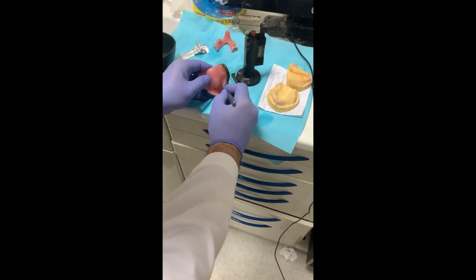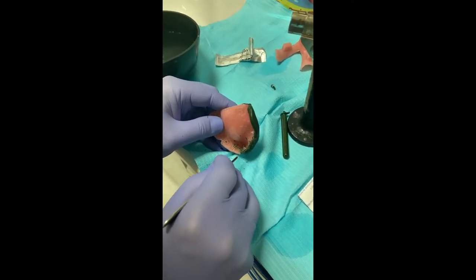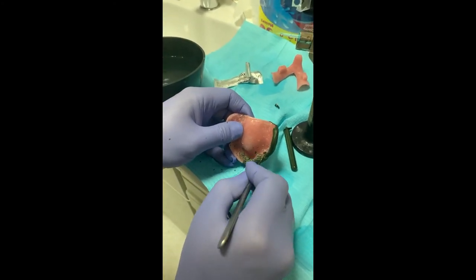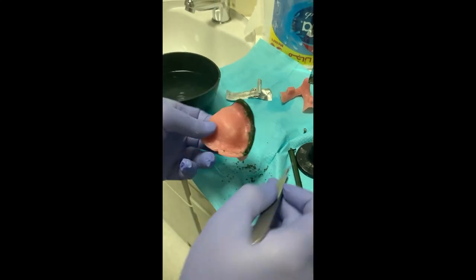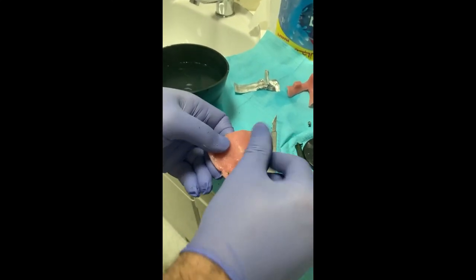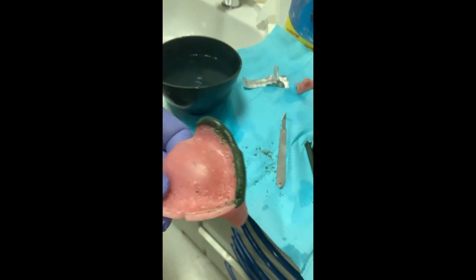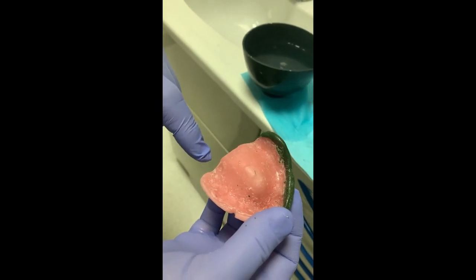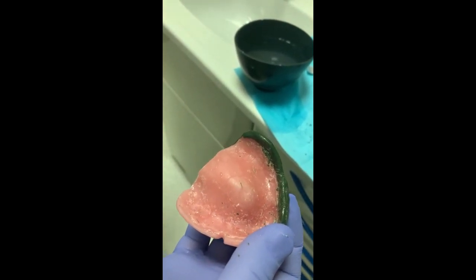For me, I'll just do some relief so that pressure areas will not appear, hopefully, on the final impression. We do the same with the other side, but with the posterior aspect we'll put it onto the fitting surface — we don't have an edge of the flange here, so we put it onto the fitting surface following the palatal area.